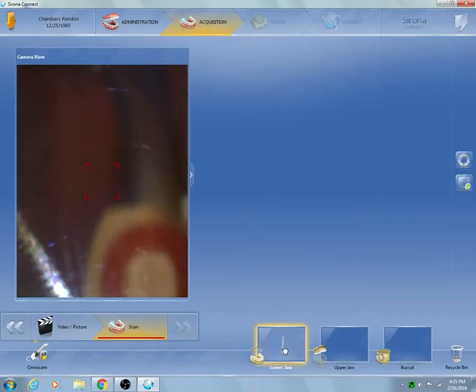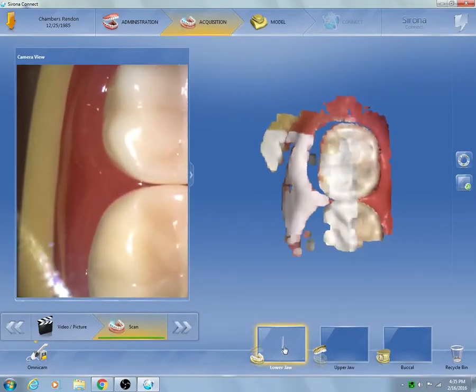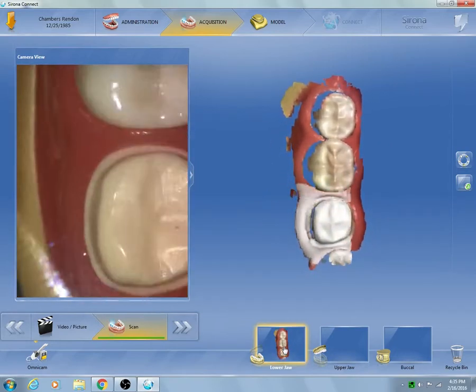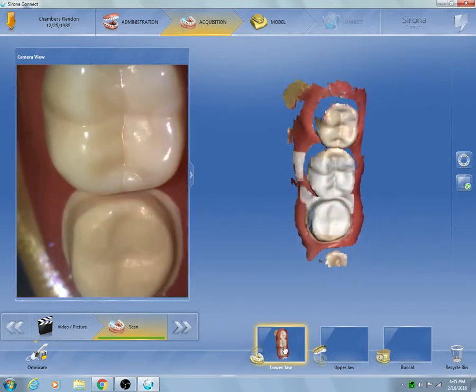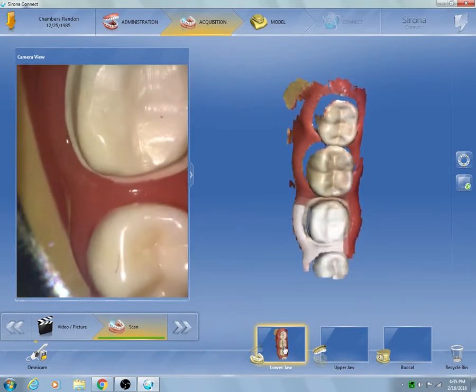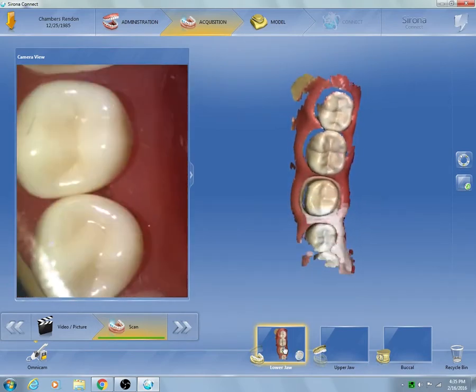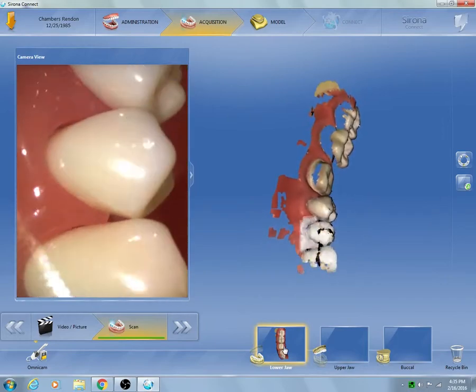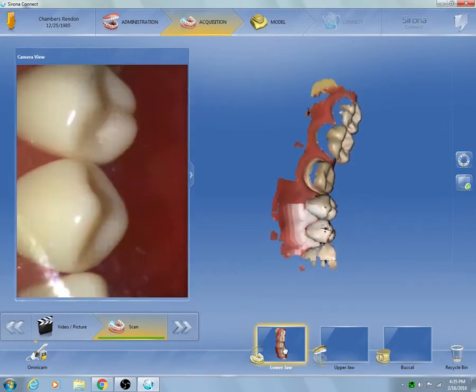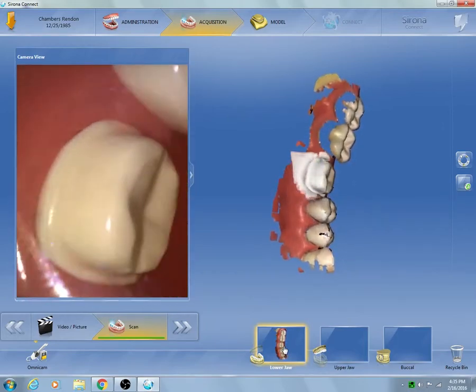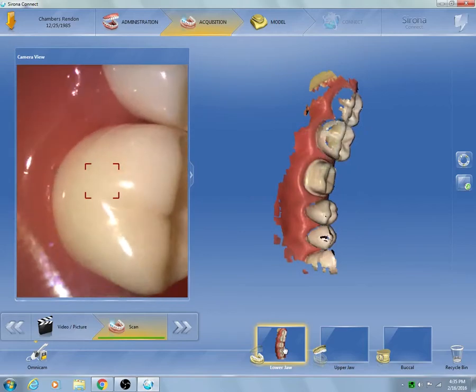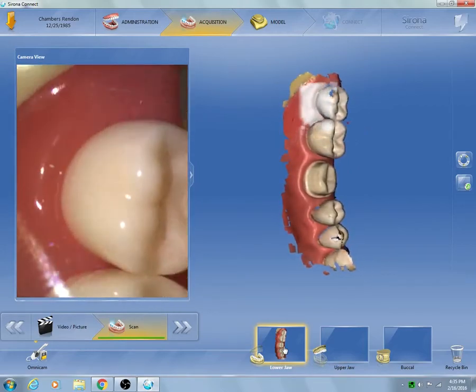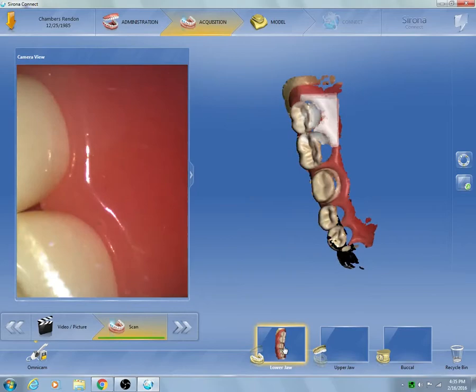At this point in acquisition we're now going to enter the patient's mouth. We're going to start on the occlusal surface, move distally, and then pull mesially. Here I rotate the camera up and down a little bit to acquire the information on the neck. Then I rotate it to the buccal facial aspect and push back distally, filling in any blue information I'm missing along the way.